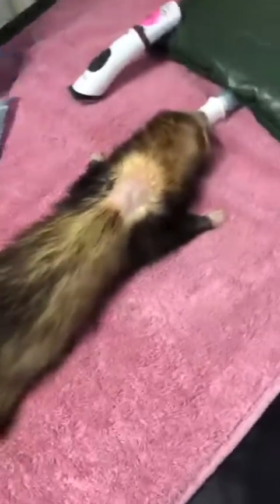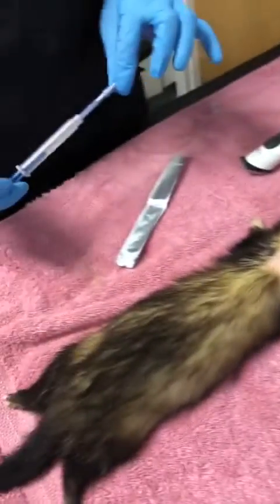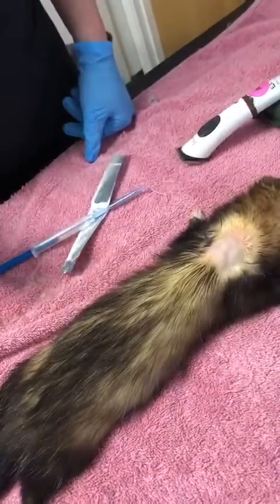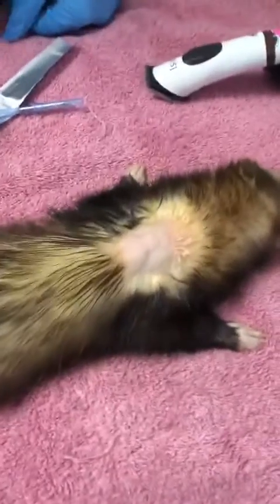Today we are going to be placing a Suprelorin implant in a female ferret to bring her out of season and prevent her from getting pregnant. What I do is clip and clean a small area around about her shoulder blade area.